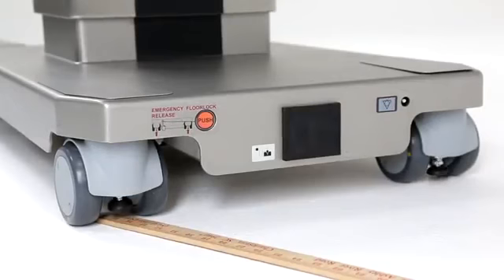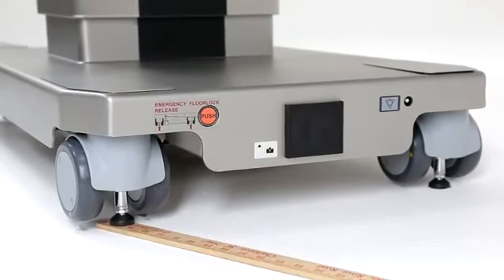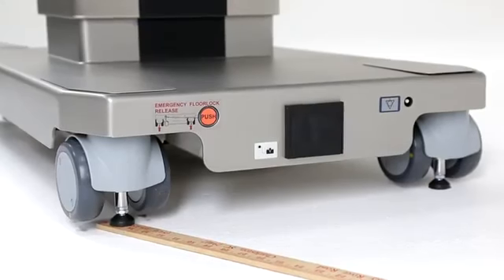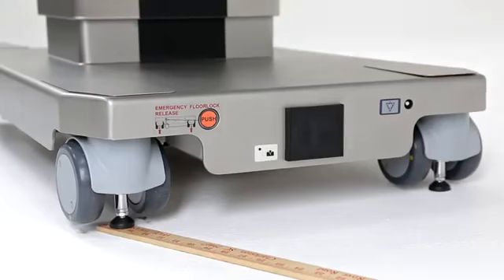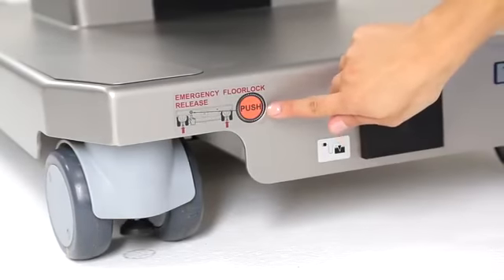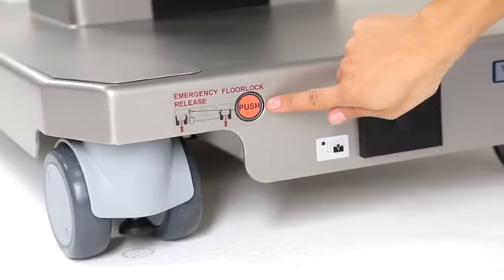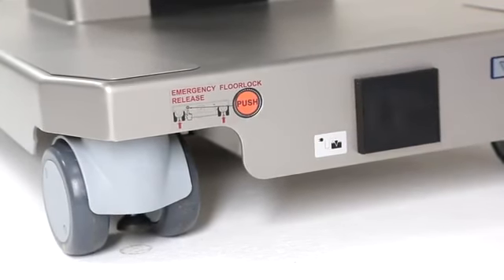Powered posts lock the table into place while compensating for any deviations in the floor of up to 0.4 inches. This advanced stability technology automatically levels the table, ensuring a stable platform. To enhance safety, Trumpf built in an emergency floor lock release to give users peace of mind, knowing the table can be quickly and safely released and moved in urgent situations.